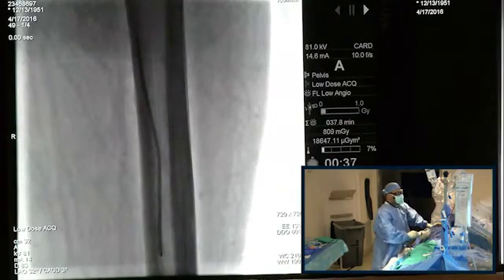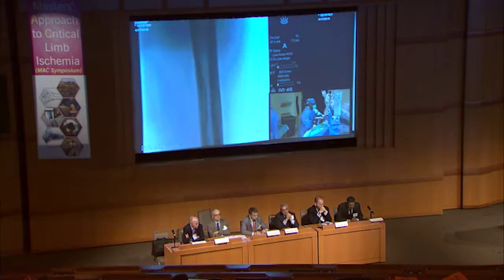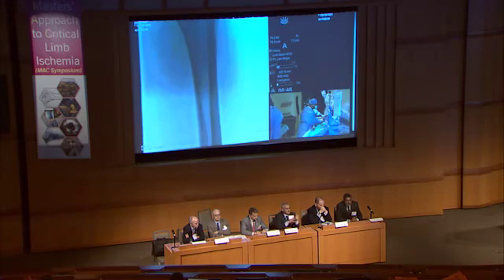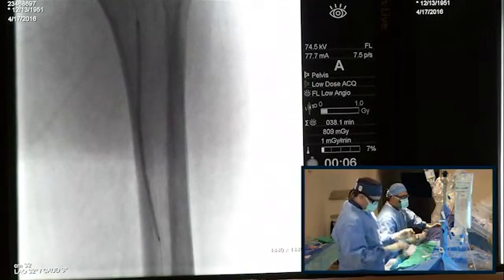So Mehdi, I know everyone is focused on the below the knee arteries, and I think it is critical, but I am also very interested in the result in the SFA because at least on the last picture I saw, it didn't look perfect to me. No, we're going to have to use DCB of the SFA, and with the DCB, we try to size 1-to-1, if not even larger, to be honest with you. That's what we have learned.